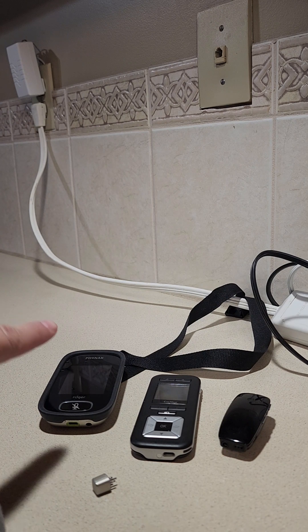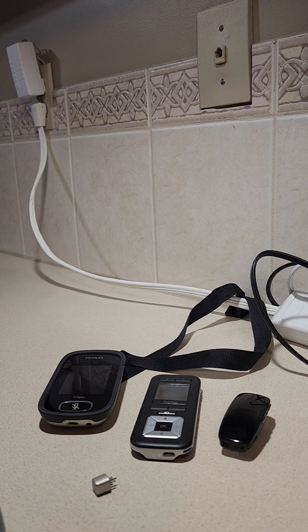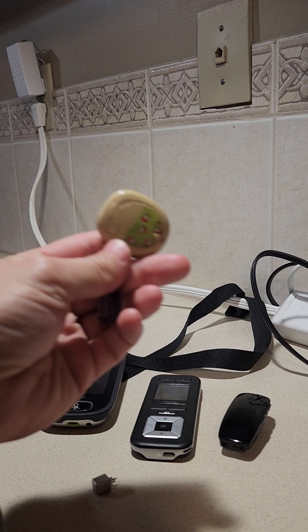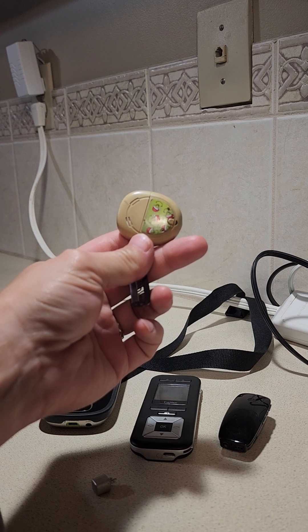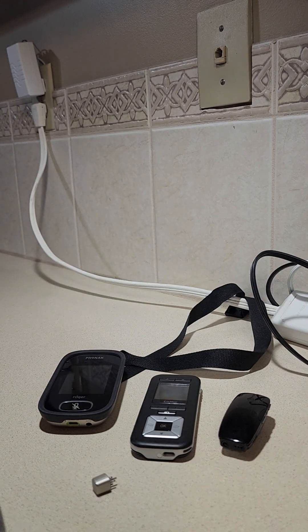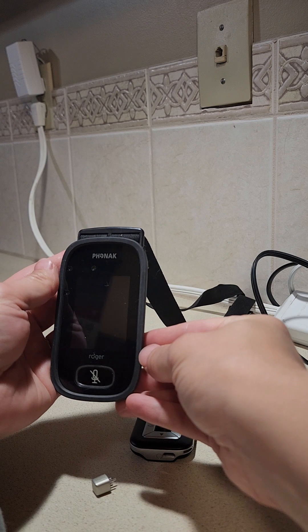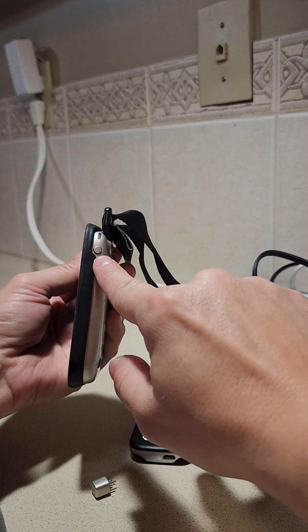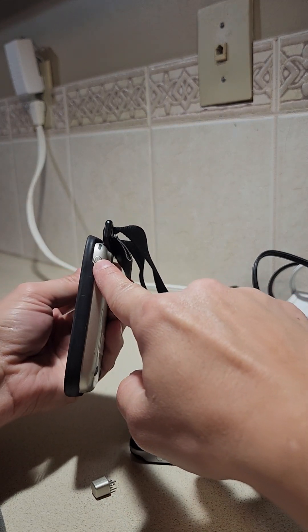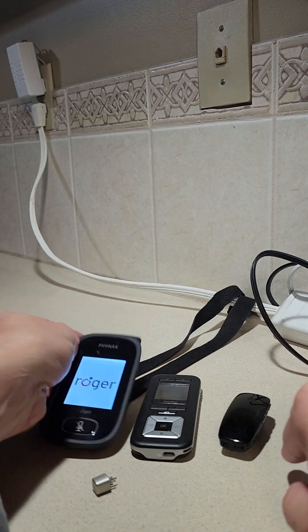This video is to connect the Roger Phonak touchscreen with the Cochlear brand Kanzo processor. First we'll need to turn on the devices by turning on the Phonak Roger touchscreen. On the side there's a power button that you can press and hold until the light turns green and the screen turns on.